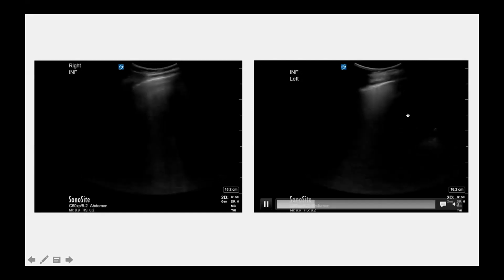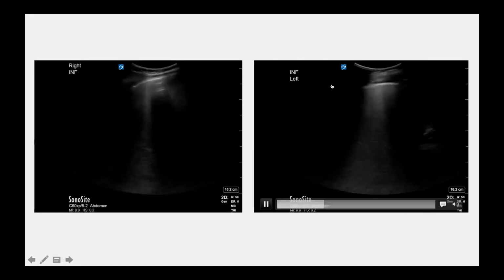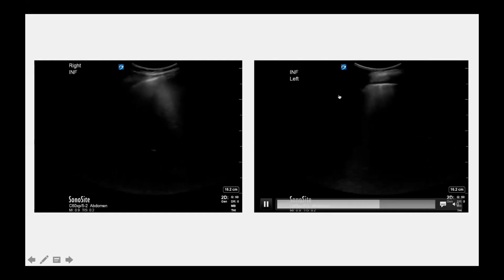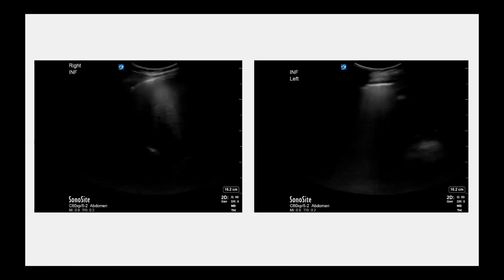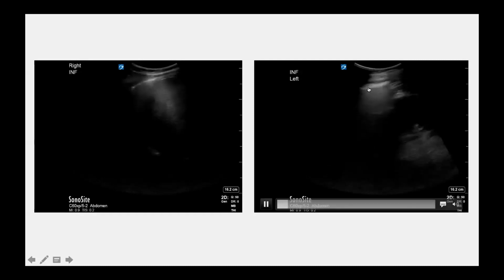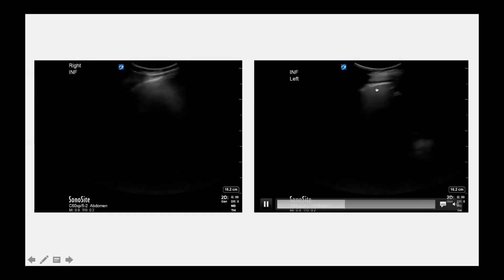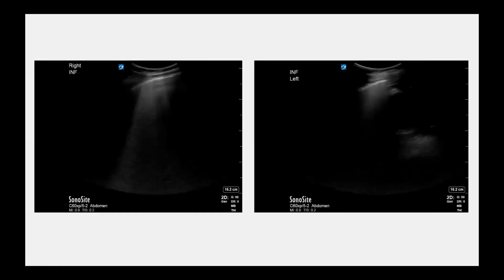So we've looked at some of those COVID cases, and we looked at the visceral pleura. If you look at the image to the right on the screen, which is inferior left, you'd see the visceral pleura has a nice linear pattern to it. We're not seeing the same shred sign that we saw with some of those COVID cases. And you can slightly differentiate the parietal from the visceral pleura with a small area of anechoic fluid. So that's an effusion right there.